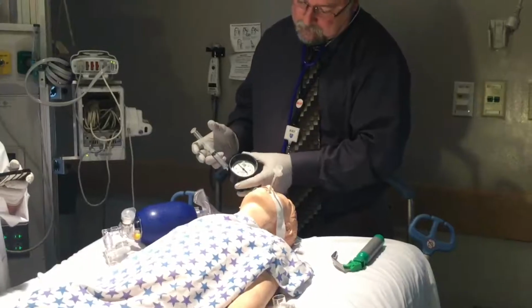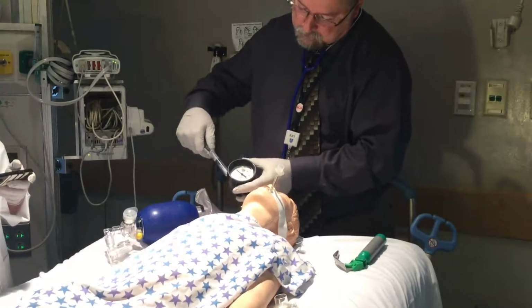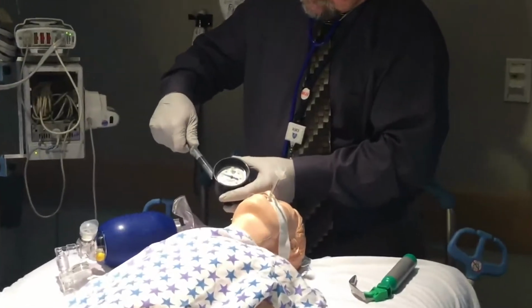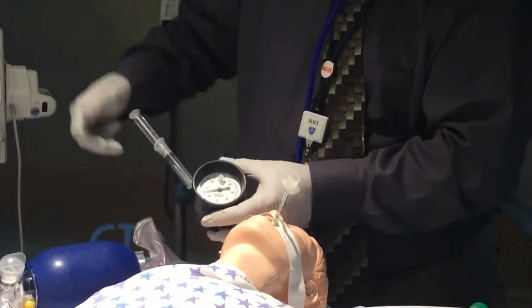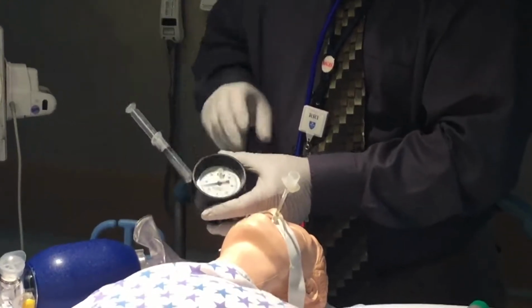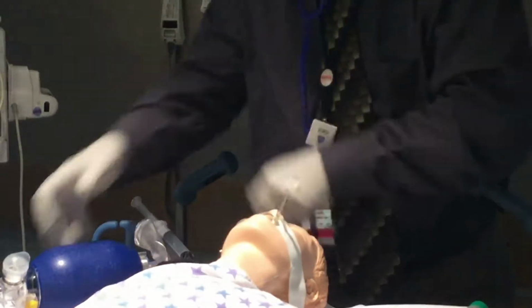Management of high cuff pressures. Decrease the cuff pressure to 30 centimeters of water by withdrawing a small amount of air from the balloon with a 10 ml syringe. Once that's been done, listen for the presence of an air leak around the cuff during a positive pressure breath.